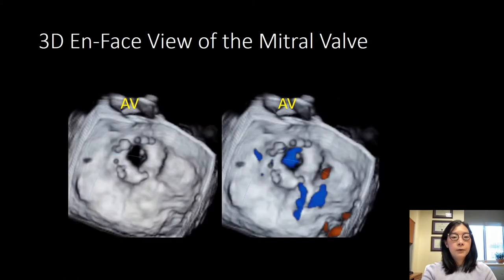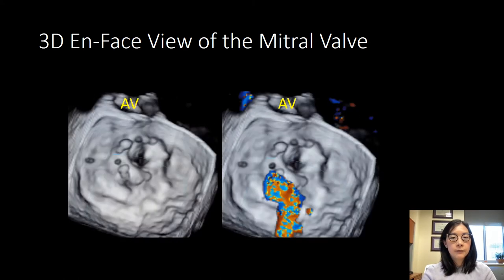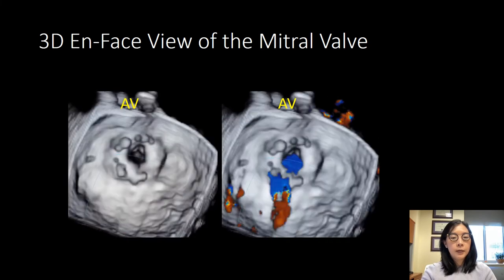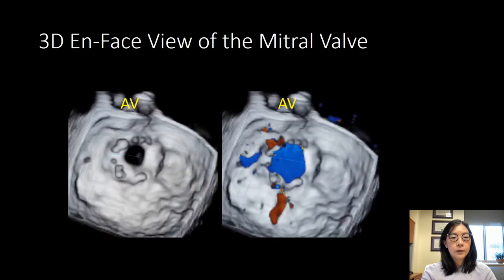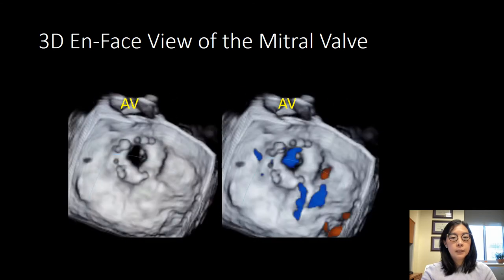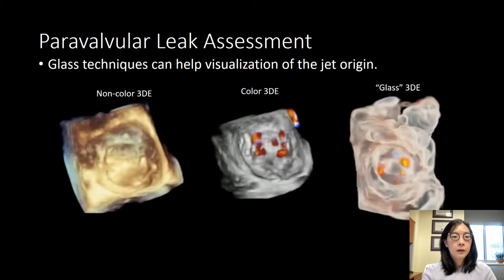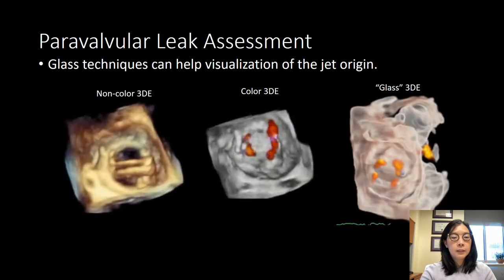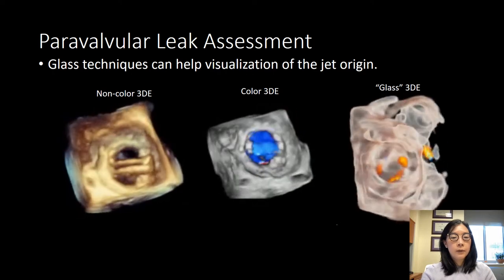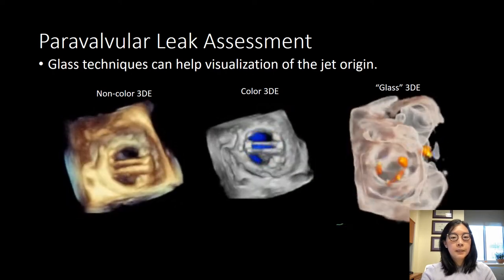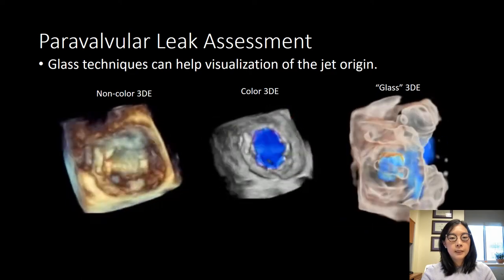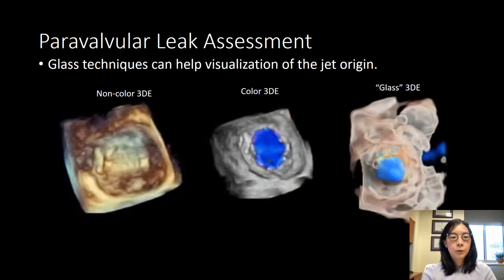For the mitral valve, 3D echocardiography has been particularly useful for identifying jets. Here we can see a color and non-color 3D en face view of a bioprosthetic mitral valve, and you can see the location of a large jet. There are some newer techniques that are being shown to be very helpful for assessing paravalvular leaks, especially with the mitral valve. There is the development of this glass technique where the tissues are made more transparent, allowing you to find the origin of the jets and see if it is valvular or paravalvular.